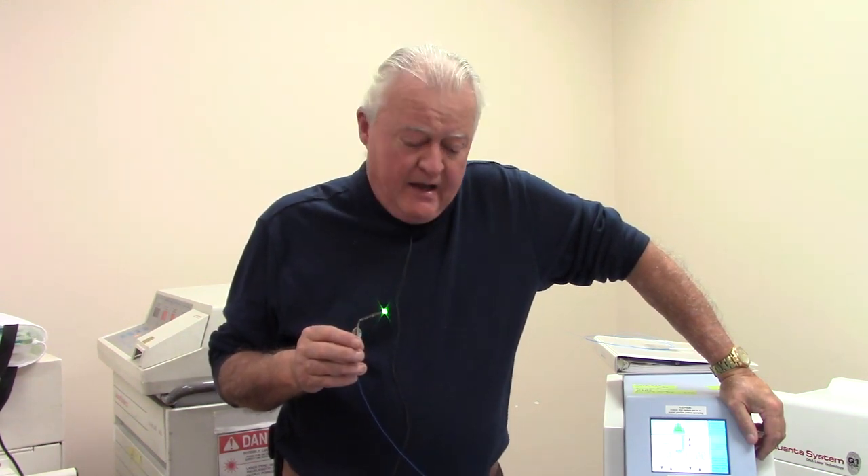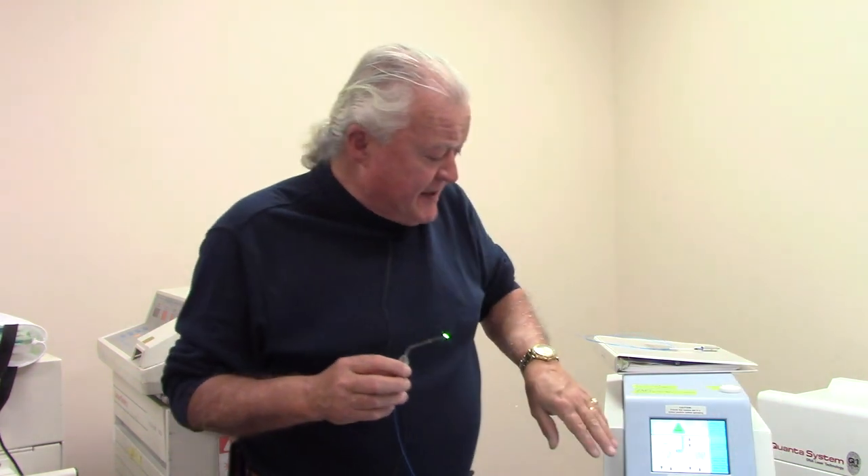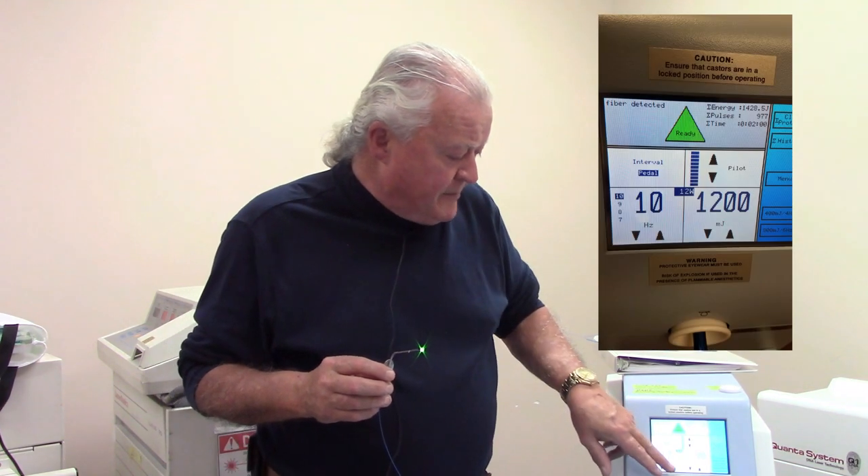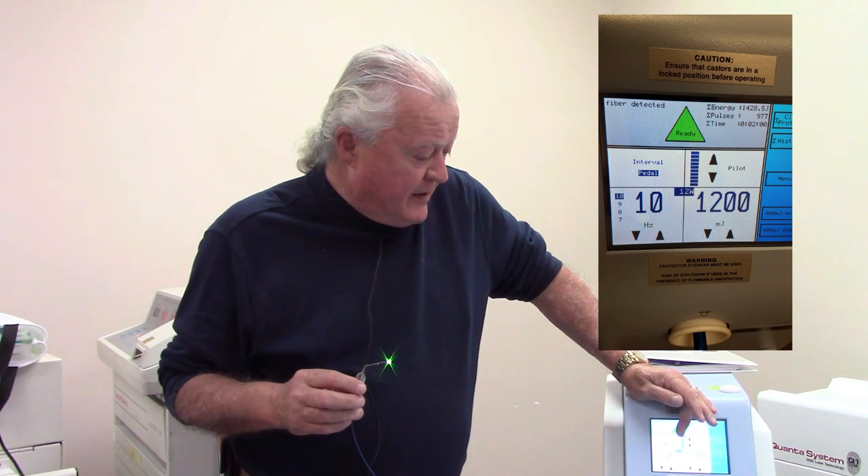In today's laser lab, we're going to be talking a little bit about laser safety as it relates to Holmium YAG laser use — in terms of eye and skin burns and not transmitting through water. For this demonstration, I've got the laser set up at about 10 times per second at 1.2 joules, which is 12 watts average power. That's a typical laser setting for fragmentation.